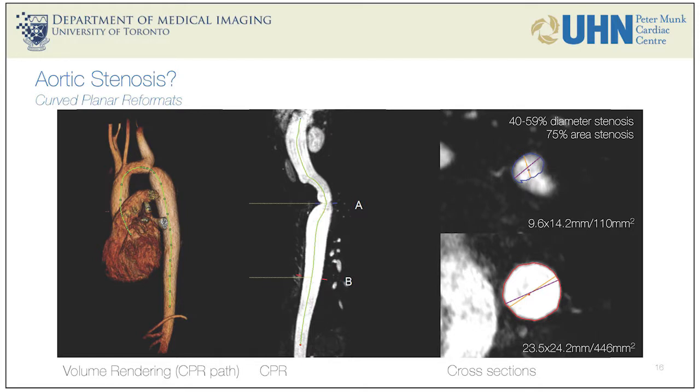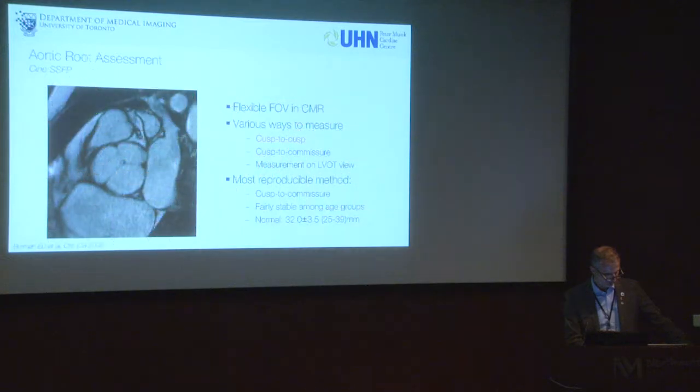The only thing to keep in mind is that sometimes the calculated gradient might not be entirely accurate because of the flow over the collateral flow here. So it's very, very important to do those measurements here as well.